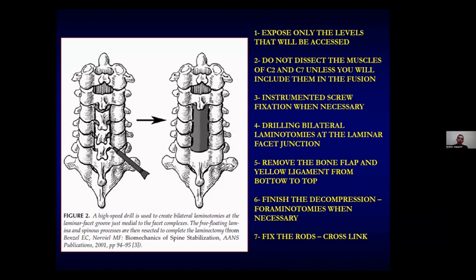Why? Most of these cases I do with the residents, and I feel more comfortable putting the screws before the decompression to avoid the risk of spinal cord injury. There are some exceptions, such as challenging instrumentations, hemivertebra, or patients with dysmorphic anatomy, where you need to decompress to palpate it if you don't have navigation.